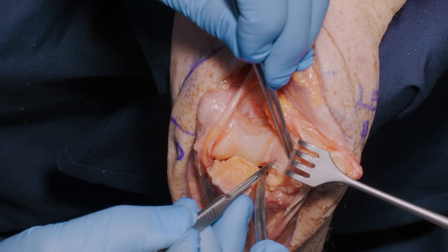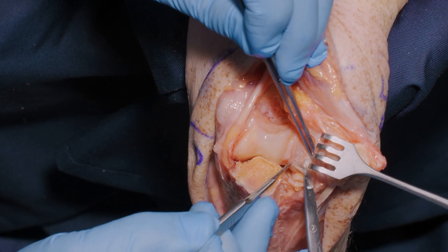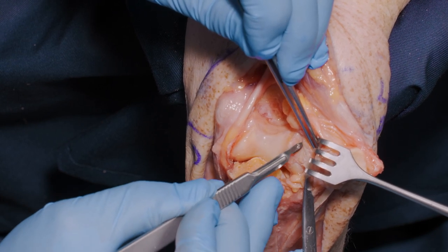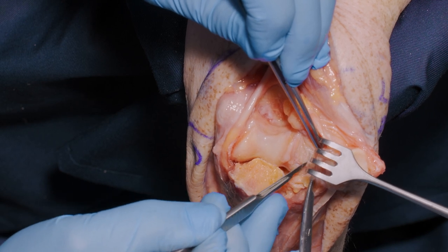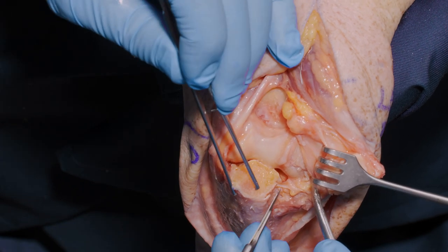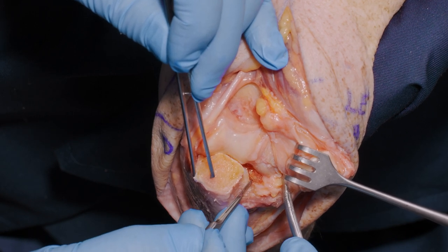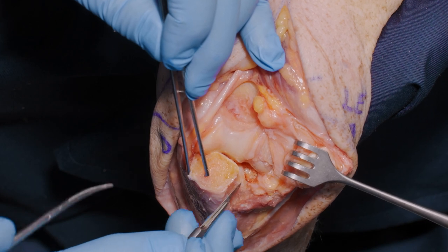The triceps has not been in any way taken off the olecranon itself, so that both its muscular part deeply and its ligamentous part more superficially remain attached to the olecranon. We can now begin to dissect on the back of the lateral epicondyle to expose the capitellum and, more distally, the radial head. Here is the capsule elevated from the sublime tubercle and the anconeus coming off more distally.